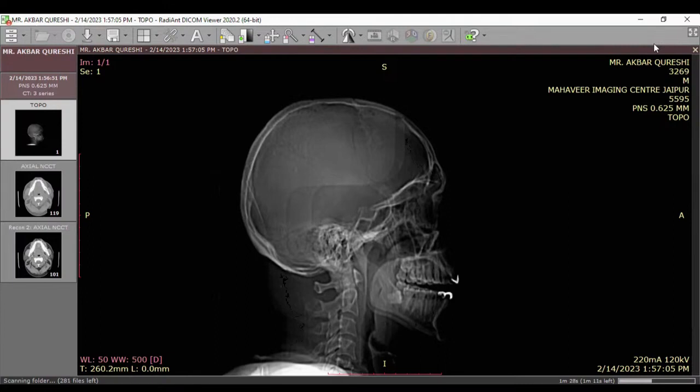So you have to follow the septum and then go behind. In the next case, I will tell you the guide is the septum. Always follow the septum and then glide into the sphenoid sinus. To enter into the sphenoid, always go gliding along the septum. That is the safest way.